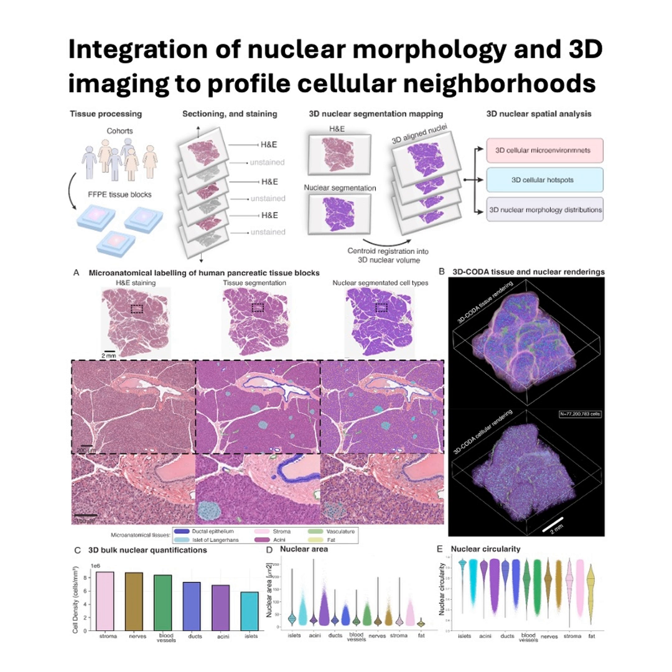Things like the acini that make enzymes, the islets of Langerhans that make hormones, but also ducts, blood vessels, nerves, fat, and the connective tissue, the stroma. And how accurate was that? Impressively accurate. They achieved 94.9% accuracy in correctly identifying these different structures, all at a resolution of 1 micron per pixel. So essentially giving every tiny part of the 3D image a meaningful label.